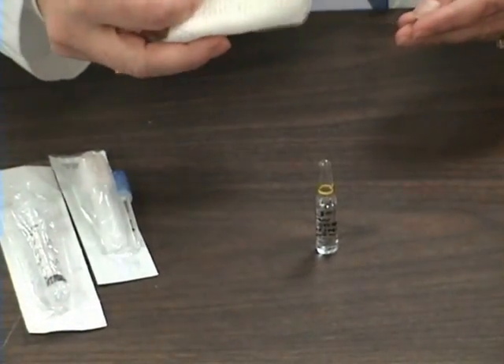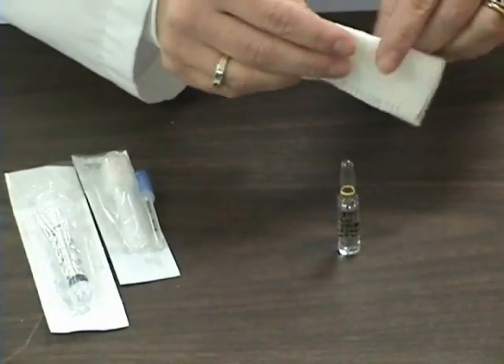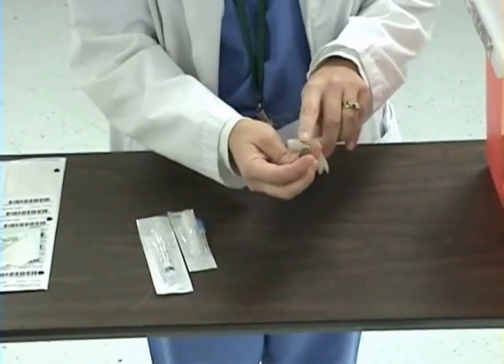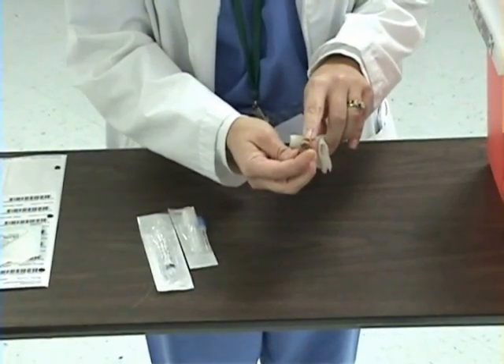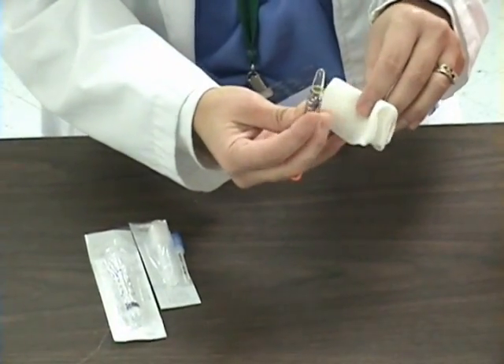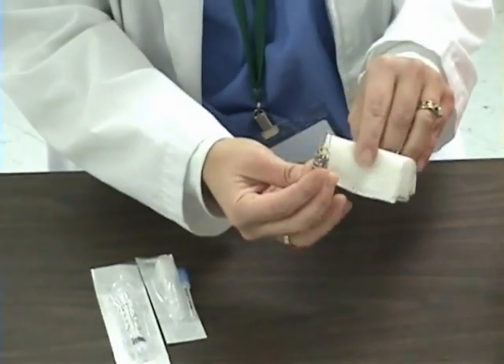The next thing I am going to do is open my ampoule. Today I am going to use a 3x3. I want to wrap my gauze around the neck of the ampoule so that when I open it, this gauze will protect my hands from the sharp glass so that I don't get cut.